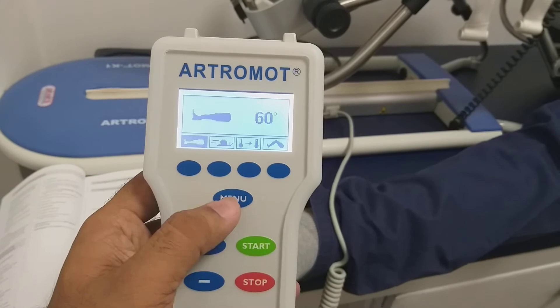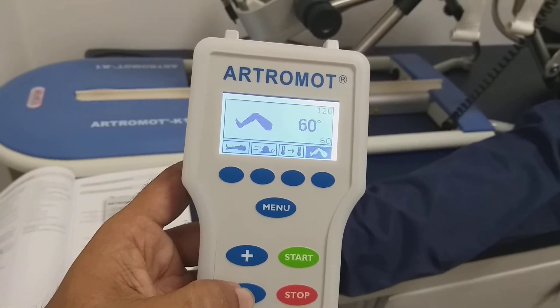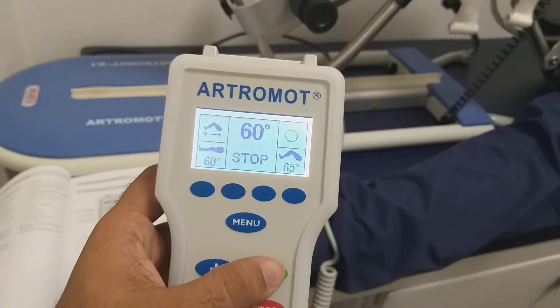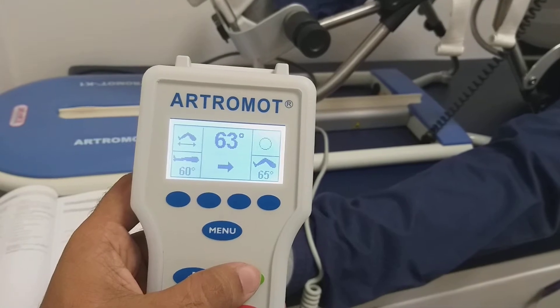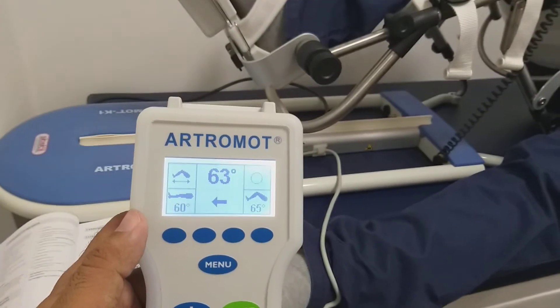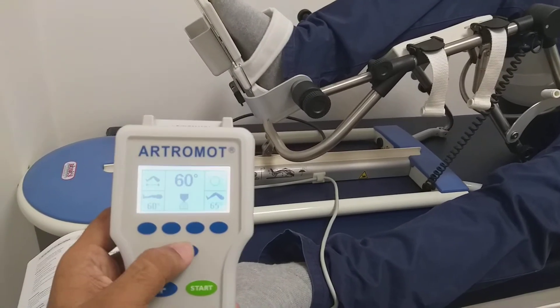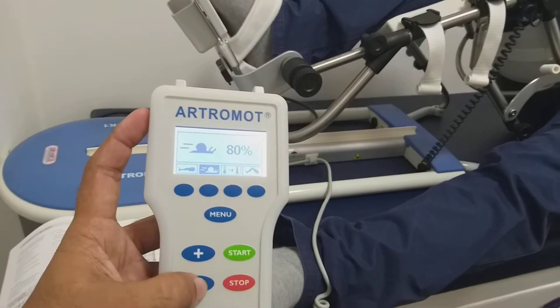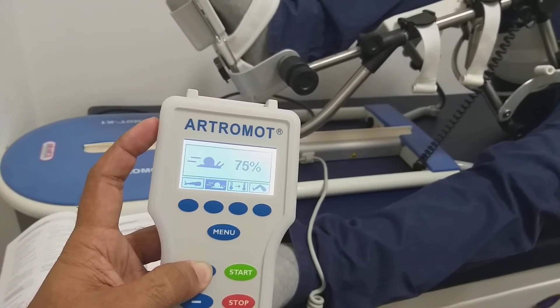Now I can start and I can change the angle of flexion also. I change the angle — flexion is 65 and the extension is 60, so it will move between 60 to 65 only now. Here we can reduce and increase the speed — from 5% to 100% you can change the speed.